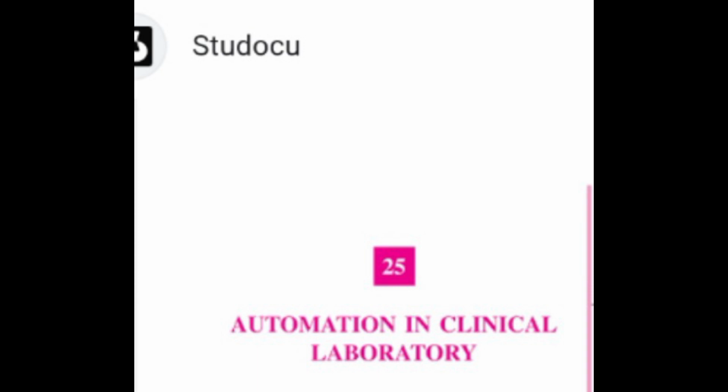Selection of auto analyzer. It is very important to plan a laboratory setup. One who is going to set up a laboratory must survey the surrounding area where they plan to open their laboratory. If the area comprises several doctors who are dependent on the laboratory report for the diagnosis and treatment of the patient, it is advisable to discuss with them before starting the laboratory. It is also advisable to discuss with them which laboratory tests are helpful for them.